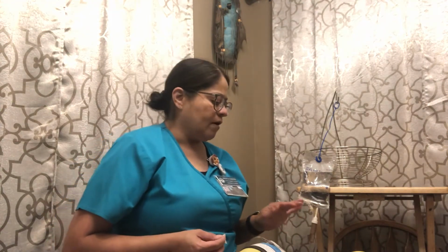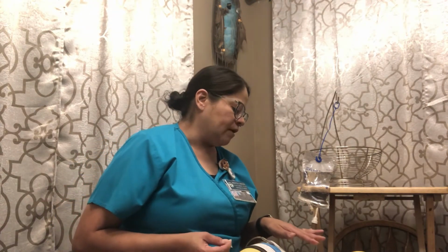Okay, remove my flush and clean my port once again. And then I will ask my patient his pain level. What is your pain level now? 3 out of 10? Okay, very good.